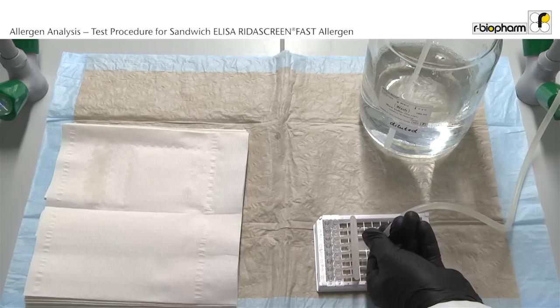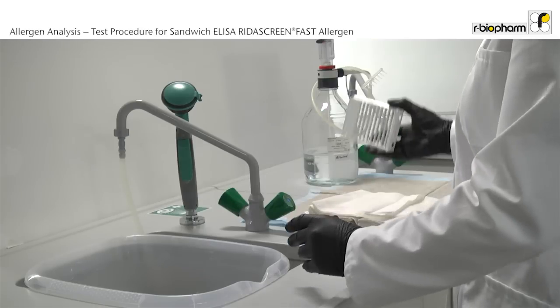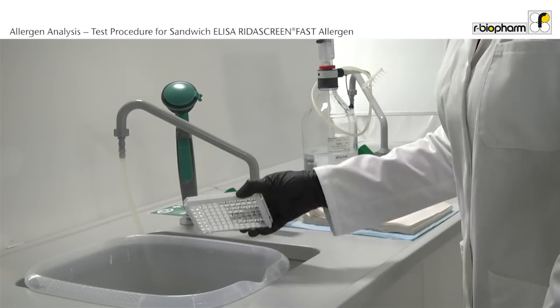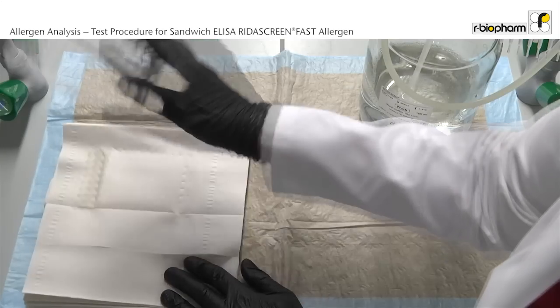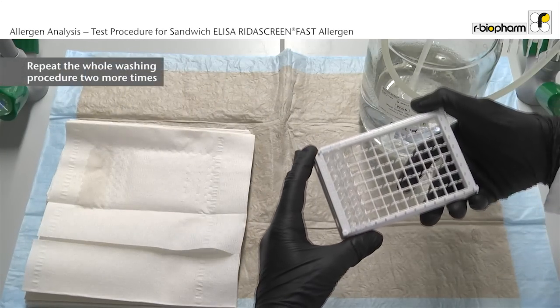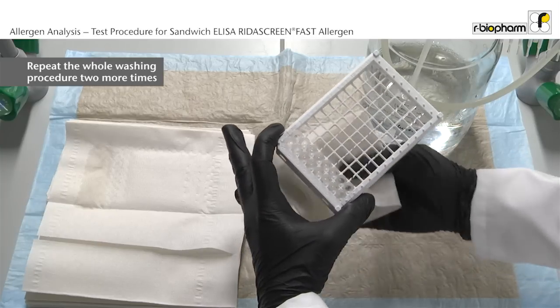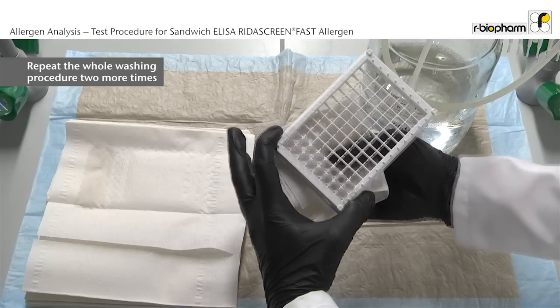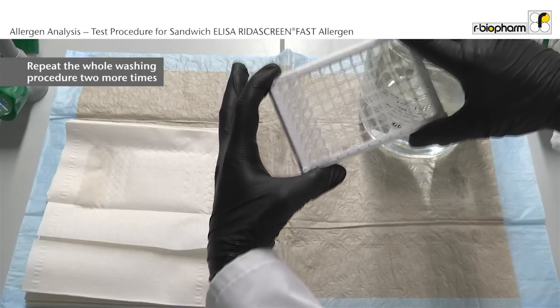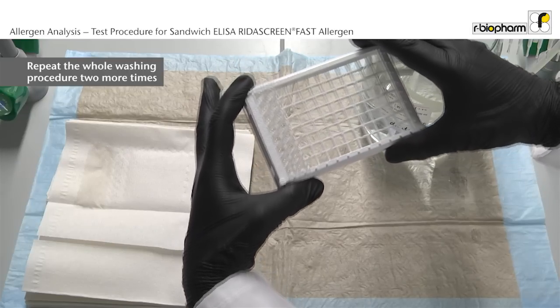Fill the wells evenly across the plate with 250 µL wash buffer. Discard the liquid from the wells using an angular and forceful motion to properly remove all liquid content. Repeat the washing step two more times. Also make sure to absorb any liquid from the plate frame and outside bottom of the wells. At the end, visually inspect the wells for residual wash buffer or bubbles and repeat tapping if necessary.